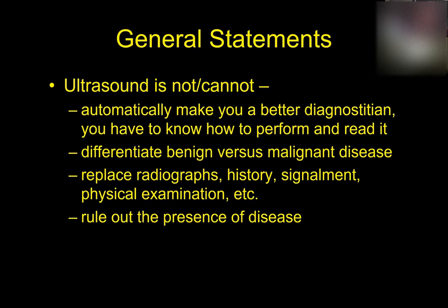I don't think it's hard to learn. With ultrasound, you just have to make yourself do it. You have to practice. Practice makes perfect, and there's probably no more truth to it than when you're trying to learn ultrasound. So there's no way that you or anybody else can go to a weekend course, at one of these big meetings, in wherever city you go to, a Saturday, Sunday, two-day course, and come out an expert in ultrasound and a good sonographer. The only way to learn ultrasound is to put a probe in your hand and a dog or a cat in front of you and practice multiple times. And then finally, you will get it to where you can feel comfortable doing ultrasound.